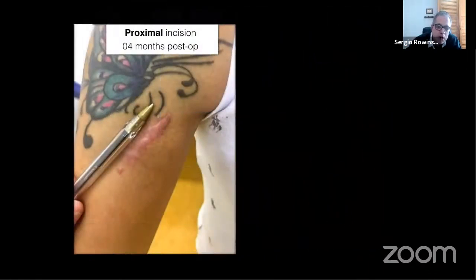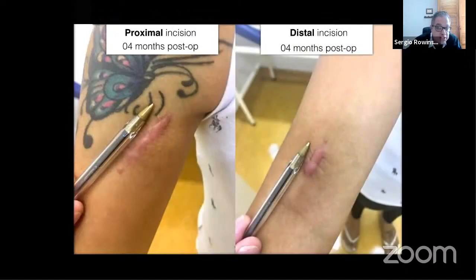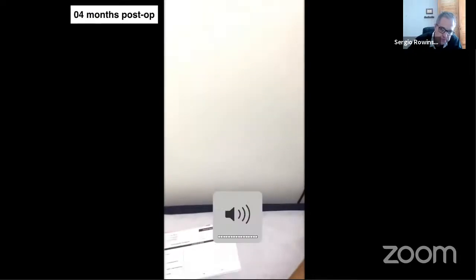So this is the proximal incision in the deltopectoral line, and this is the distal incision that I do a little bit different. I'm going to show you, and we have many keloids in my hospital, which is absolutely out of control. This is 4 months post-op. Let's listen to what I'm saying. I am saying in Portuguese, and I am automatically translating to English.